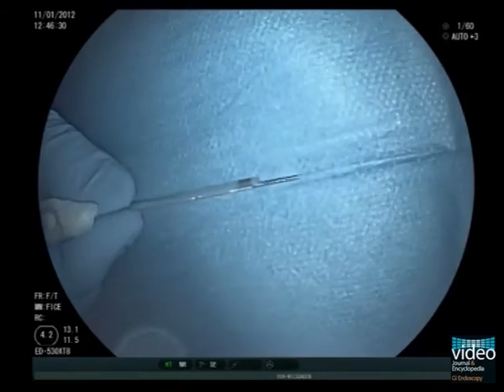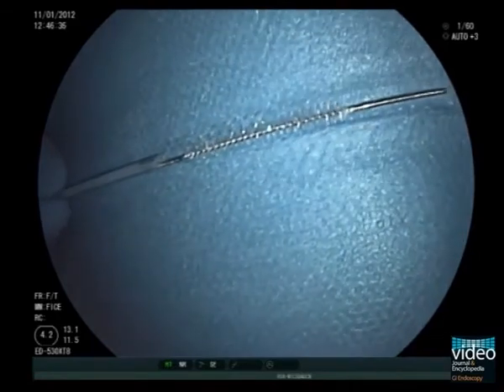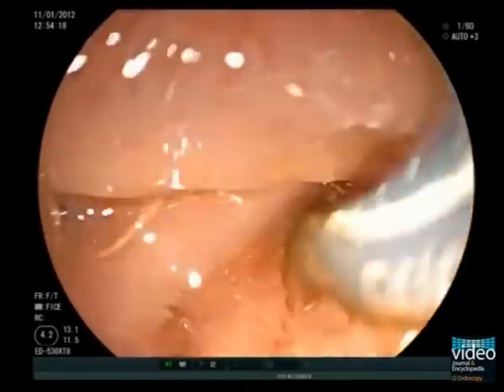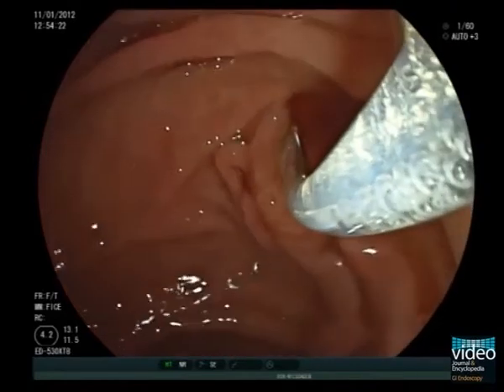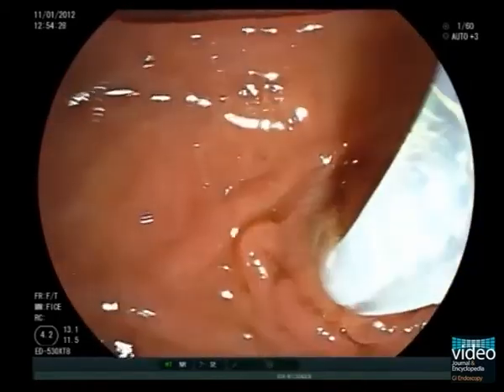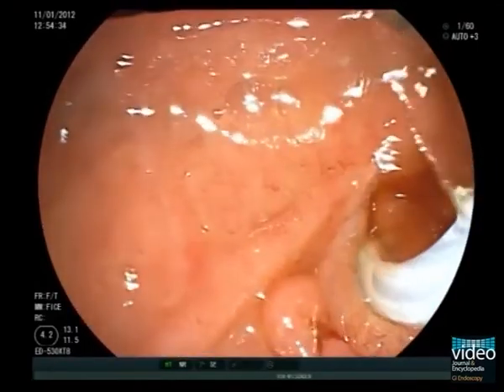Here we see the 25 mm long bristled brush that can be advanced over a guide wire and extended out of the sheath once it is positioned in the correct area. The device is inserted in the bile duct and advanced under fluoroscopic monitoring to the desired position. The opaque distal tip of the cytology brush is placed into the stenotic left hepatic duct. The brush is then extended out of the sheath to brush the lesion and thereby scrape cells from the surface of the stricture for cytological examination.